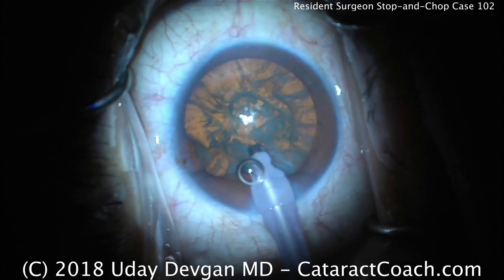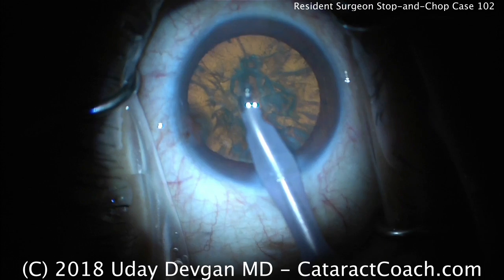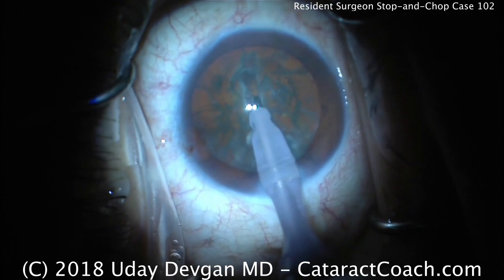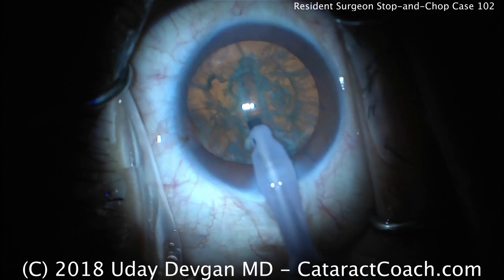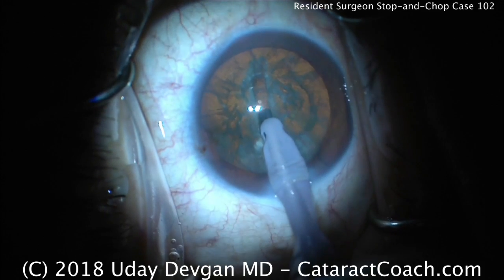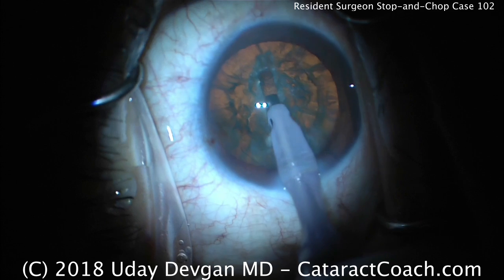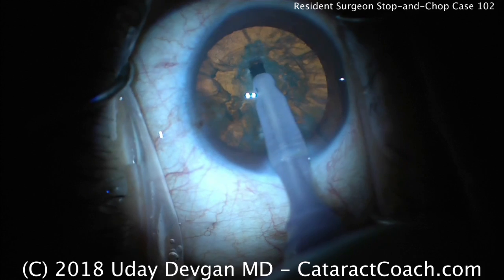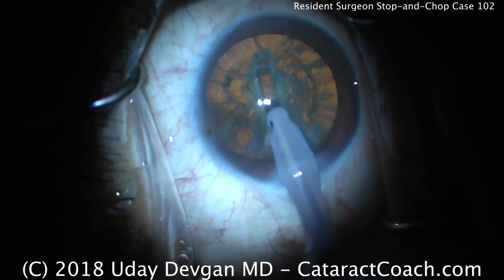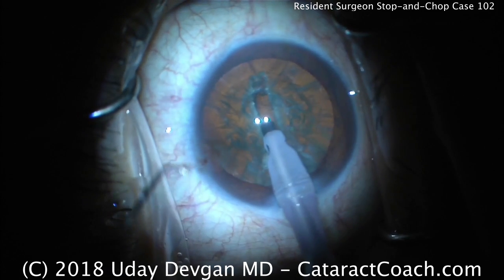What I'm looking at is not only the groove itself but the corneal light reflex in the center of the cornea — seeing how well the resident keeps the eye in a normal primary position during surgery. The light reflex should stay right in the middle. It's a nice groove here; I'd pull back a little bit more to start the groove a little earlier. Now widening up the groove. We're not really starting the groove sub-incisionally, so the resident may want to groove this way, then rotate the nucleus 180 degrees and re-groove the part underneath the phaco probe. Notice how the resident's really taking his time — no rush. The nuclear density is moderate.